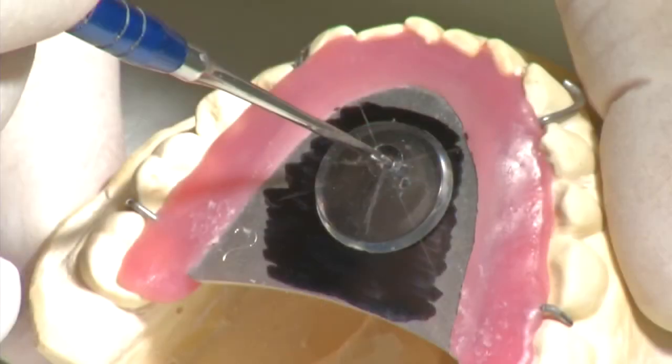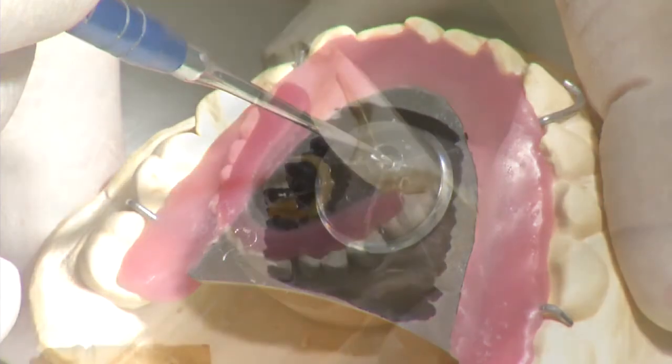If the second gothic arch is also positioned exactly on the crosshairs, the plexiglass roundel can be drilled in the position of the tip of the arrow and fixed into place using adhesive wax.